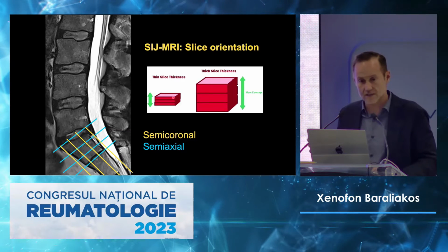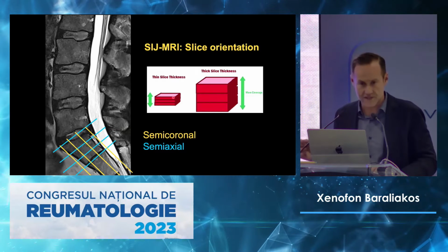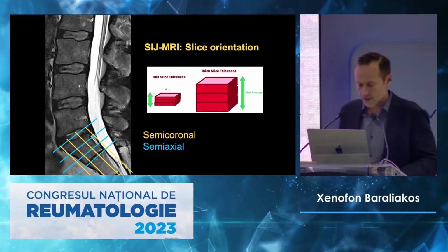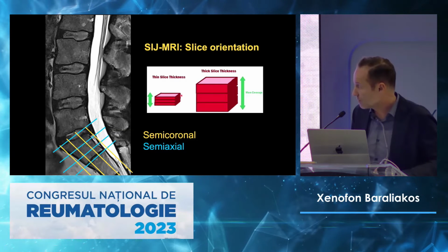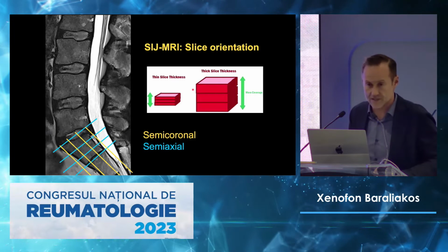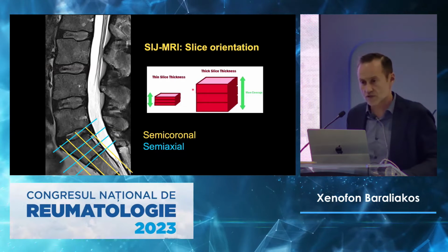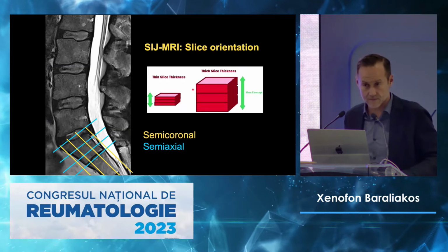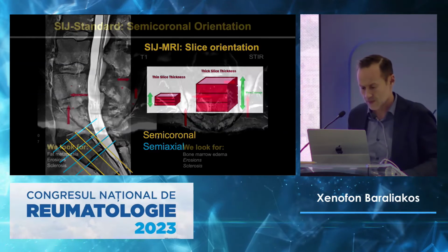So maybe you also get wrong information because of a vessel. And the longer the examination takes place. So if you have 1 millimeter or 3 millimeter slices, it's a big difference. Usually we use 3 millimeter slices for the normal MRIs. That's what every radiologist should do.